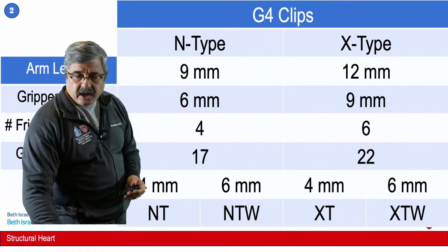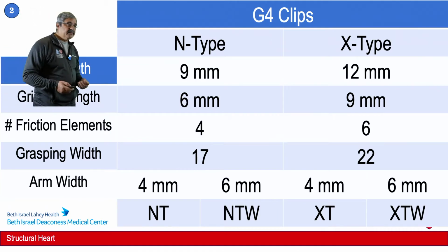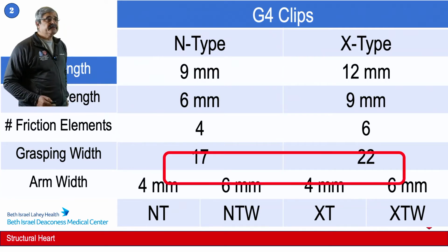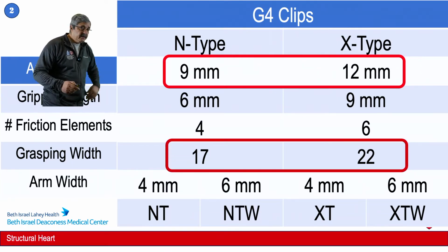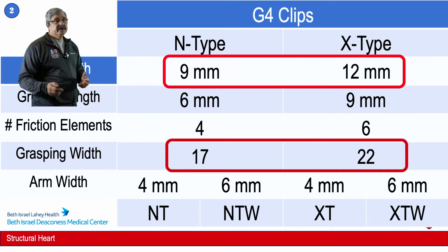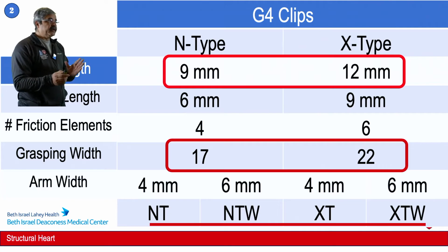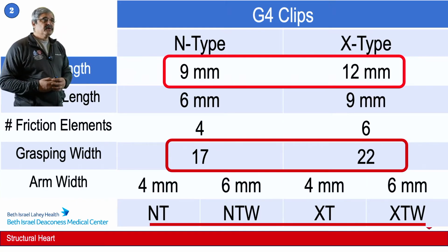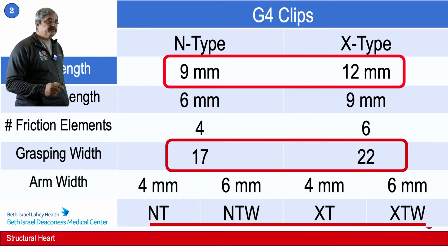Now, if you look at the two different kinds of clips, they have the clip length, the arm length, the gripper length, and the friction elements. These are the ones that you use. However, the more important, bigger differences are the clip arm length is 9 millimeters. This is 12 millimeters. The flail gap that they can address is about 17 for the N types, 22 millimeters for the X types, and the N type W types are about 2 millimeters wider than the non-W version. So this is beyond the scope of this presentation right now to go over the specific details, the kind of lesions that it will be done. But we have now two choices in generation 4 clips.